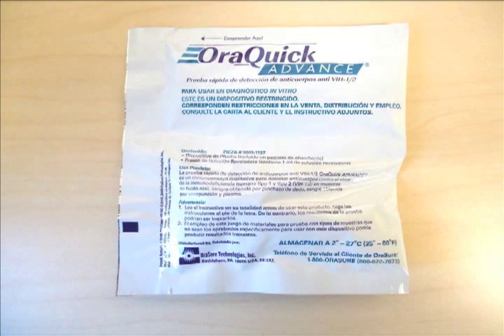The OraQuick Advanced HIV 1 and 2 antibody test is a manually performed, visually read immunoassay for the qualitative detection of antibodies to HIV-1 and HIV-2 in human oral fluid or whole blood. This video will demonstrate the steps to perform this rapid diagnostic test.